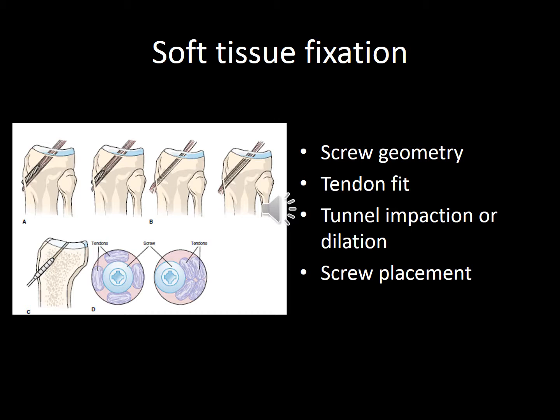Controversy exists regarding the placement of tibial interference screws. The interference screw may be fixed by inserting the screw on the side that is eccentric or down the center of the graft strands. Concentric screw placement maximizes the contact between the graft strand and the bone tunnel wall, providing a greater surface area for healing.